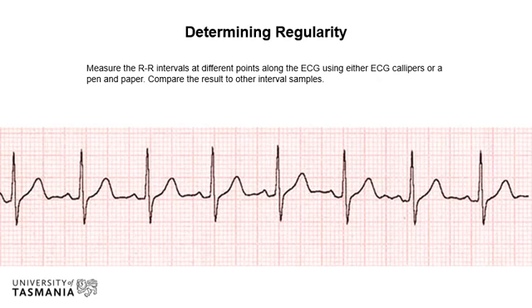It won't be 100% the same each time just due to natural variances, but if it's within a small box or two, you can be pretty confident in saying that rhythm is regular.